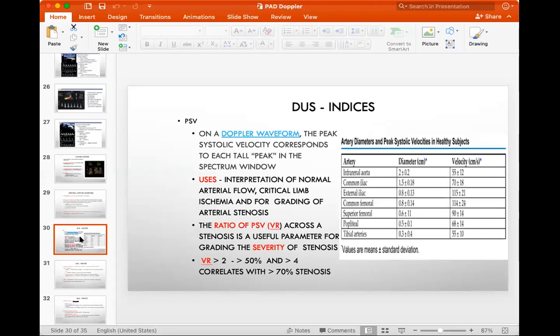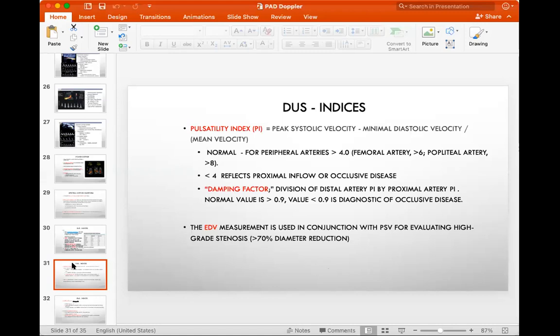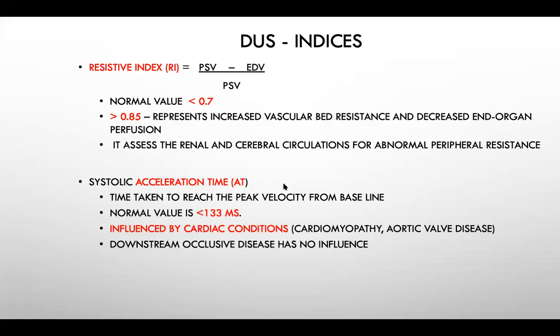This is also an indirect way of saying the patient has parenchymal disease concomitant with the renal artery stenosis. That's the clinical decision you have to make. A bilateral renal artery stenosis is a different story. Then you need to be aggressive, because of avoiding ischemic nephropathy.